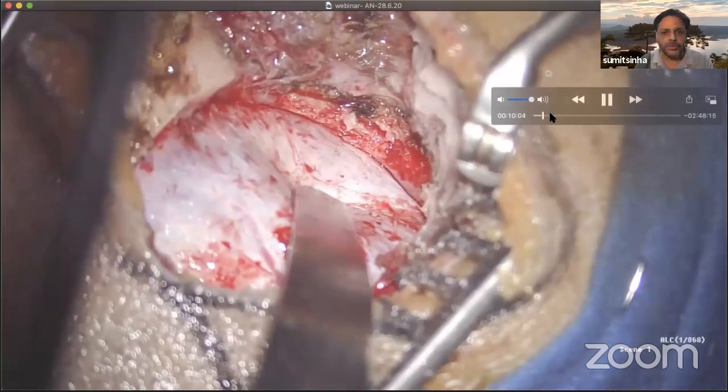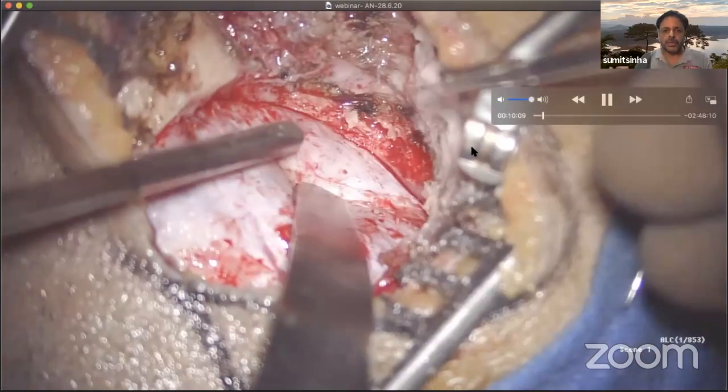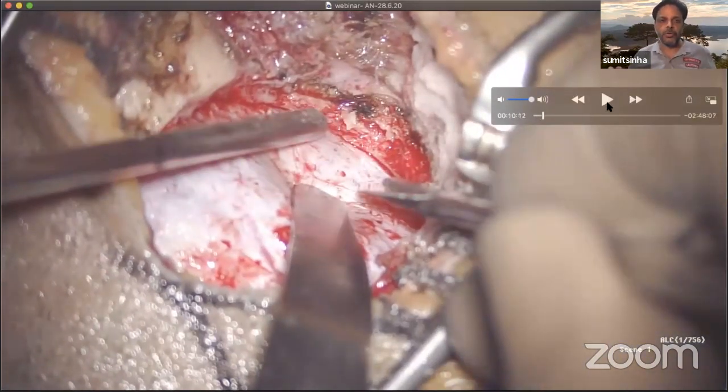Now the bony work is complete. The second most important step before you proceed to opening the dura, what I do personally, is release the CSF through a small dural opening. Now a mini opening in the mini opening. This is a great help during the surgery before you embark on opening the dura completely.